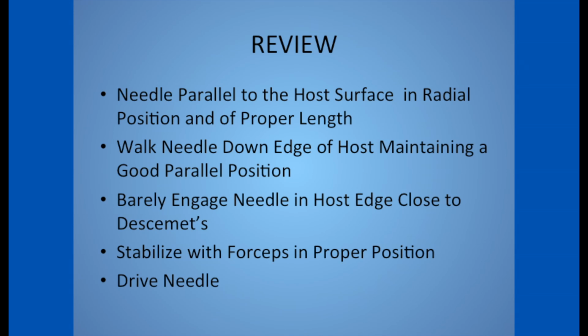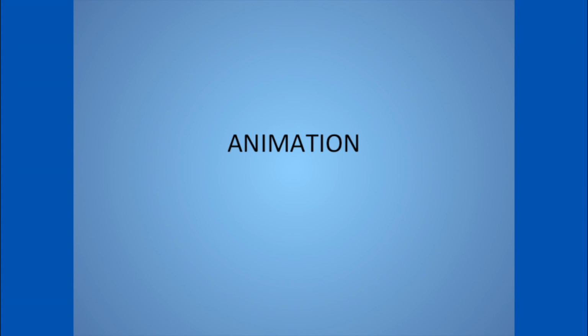So let's review the steps in word form. In the following slides, we'll show you the same information, but at high speed to make it into an animation.